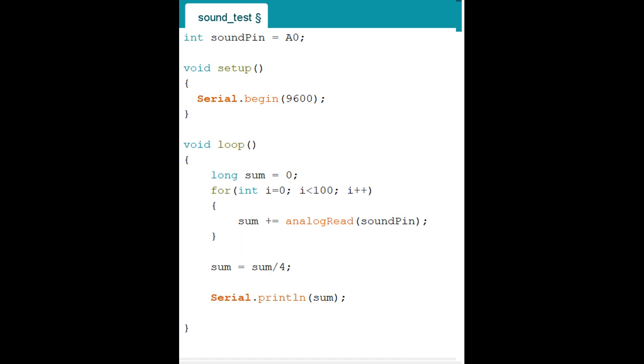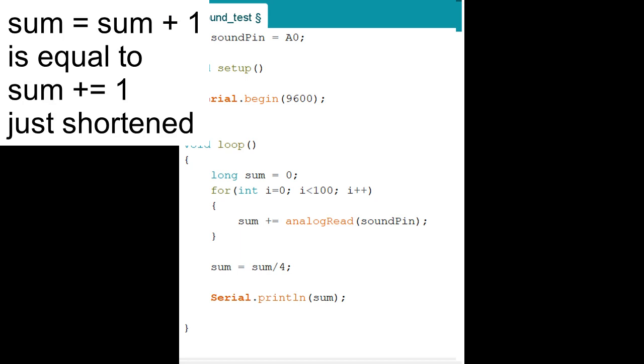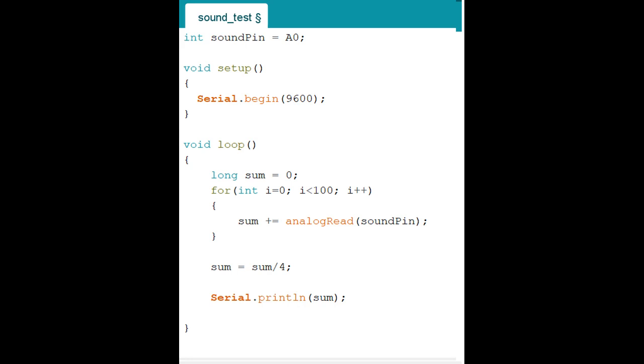Okay, so indentation, and then I call it sum, which I'm calling back. I assigned earlier that sum is going to be the end number, which is going to be long, and you start from 0. So right now sum is 0, right? And then plus equal. Plus equal is another special calculation sign in computer programming. That means sum is adding on top of sum. In the for condition, i plus plus means i keeps increasing one by one by one by one. But this sum is adding whatever is called next on top of it. So it's more like an accumulation.